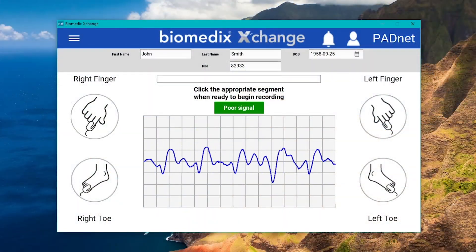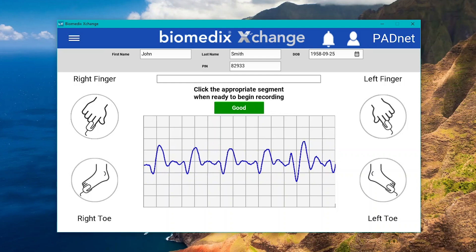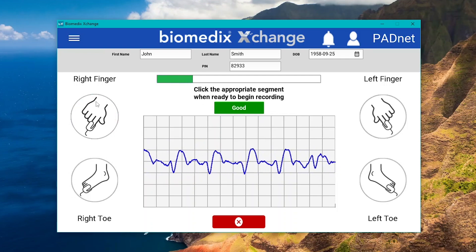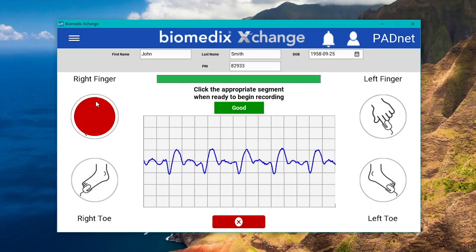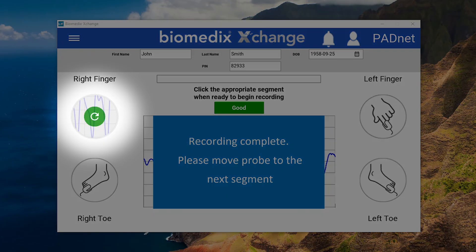When the software is displaying waveforms with consistent shape and size, you may then begin recording by clicking the appropriate segment on the software. As waveforms are gradually recorded, the progress bar will indicate how much time is left for that segment. After completing a segment, the software will automatically notify you if there were any issues with the recording. Otherwise, you may also select it again at any point to re-record those results if desired.